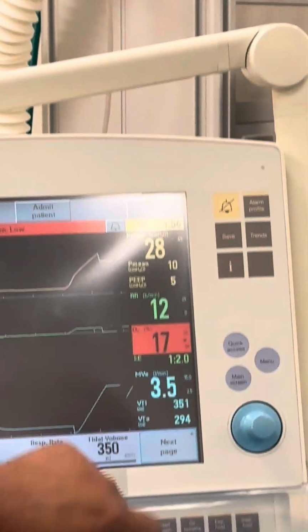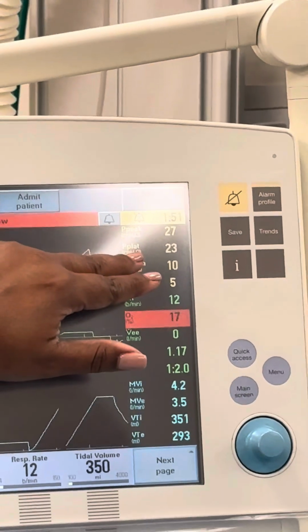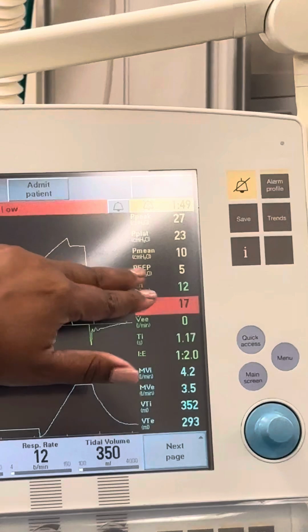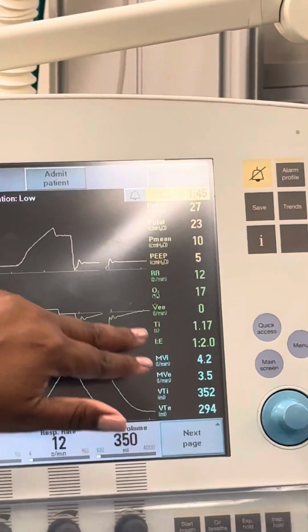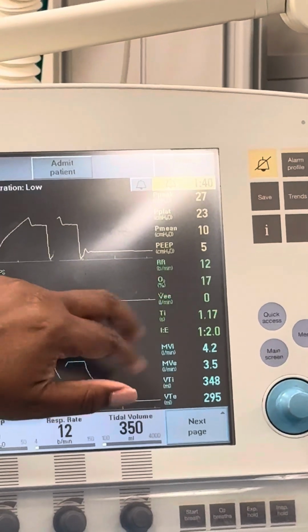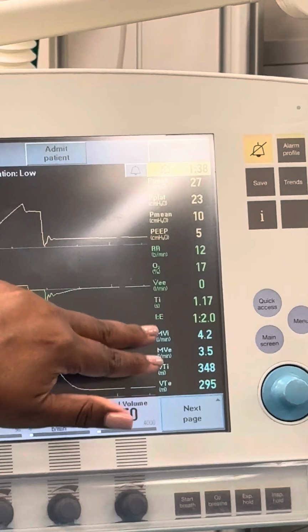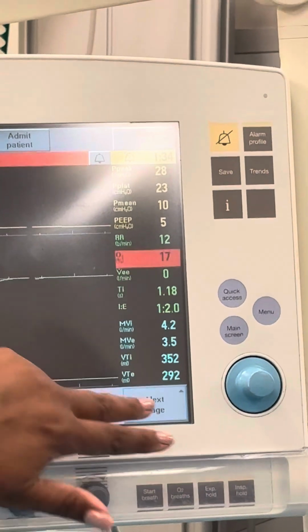Go to additional values, which is your next page. It gives you PIP again, but also gives you your plateau. Gives you mean airway pressure, PEEP again, total respiratory rate, FiO2. Usually we don't do your flow. That's your I time, IE ratio. I don't think y'all went over these before, but your exhaled tidal volume.